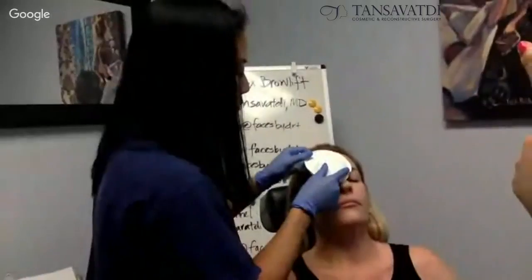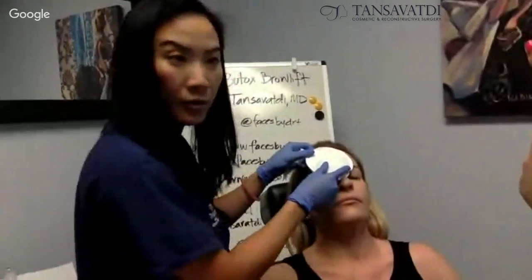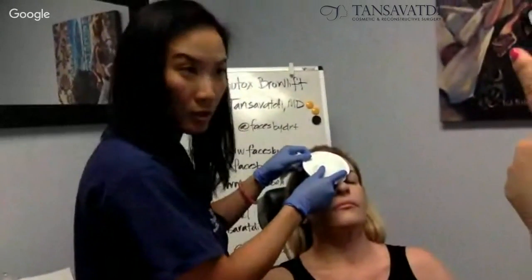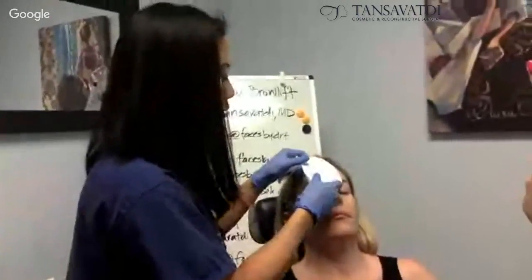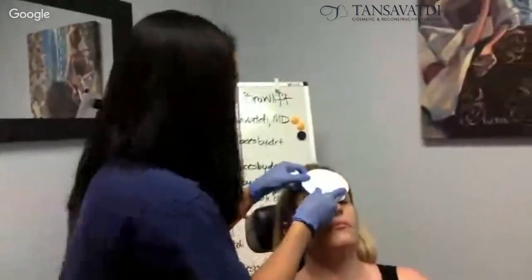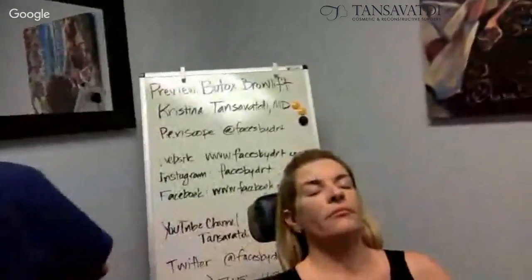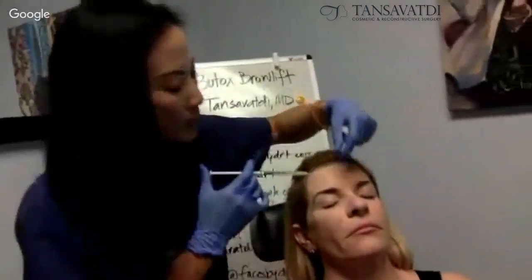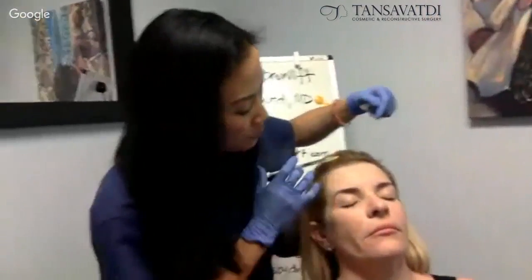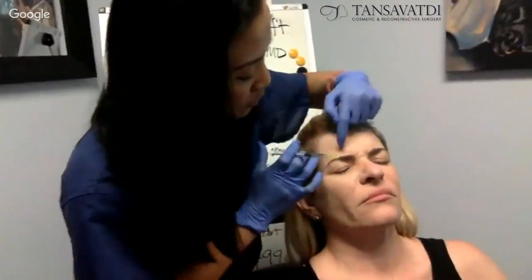I'm going to start doing just the center first, and you can see through the video pretty well here. Just so that you can see where the injection sites are in good detail. So first, I'm going to start from above. Have you frowned for me again? I want to see where those muscle actions are.